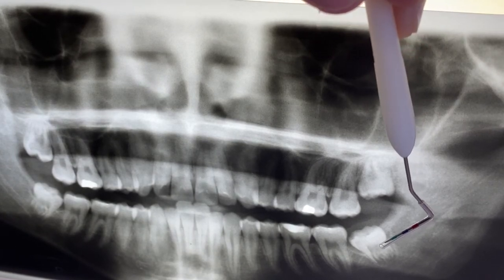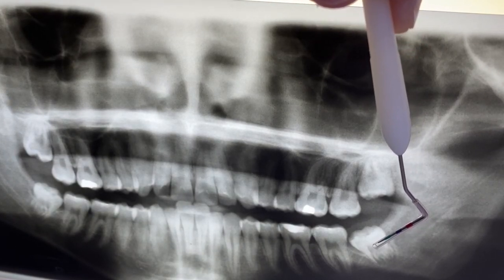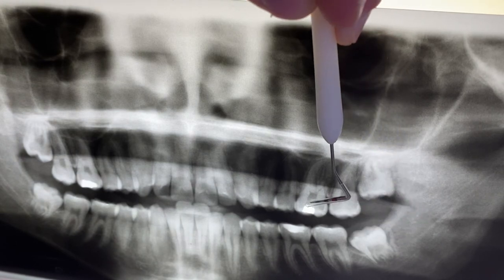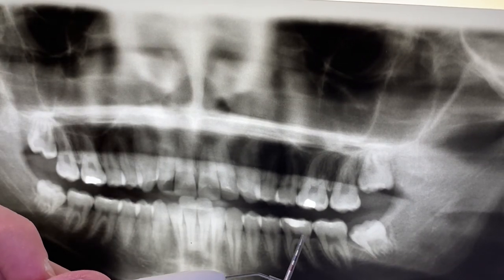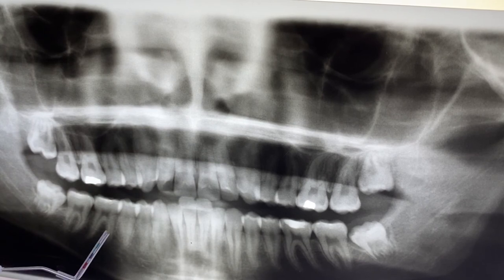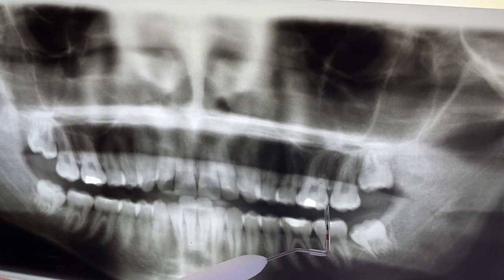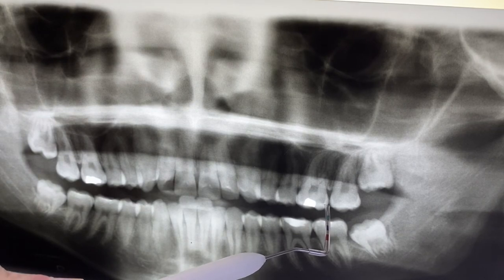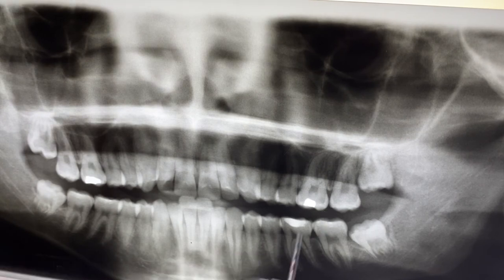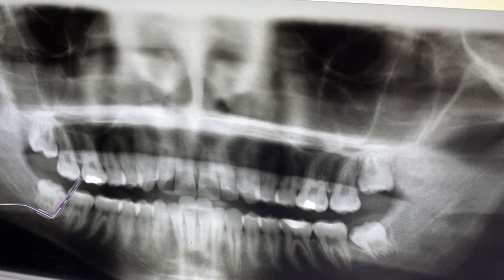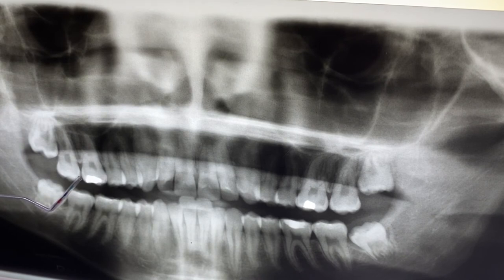We can't really see small cavities because that's not what this type of x-ray is intended for. We can see a silver filling up here, this is also a silver filling, we can see a tooth-colored filling down here, and maybe some small tooth-colored fillings here. This looks like it might be a cavity, but I'm not 100% sure because this type of x-ray gets a lot of distortion, so the image may not be accurate. I'd need a bite wing to be able to say yes, this is a cavity versus this could just be some distortion or discoloration on the film.